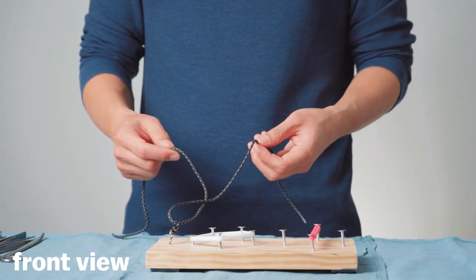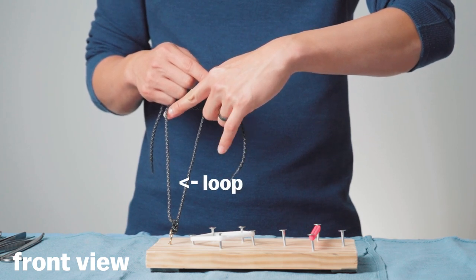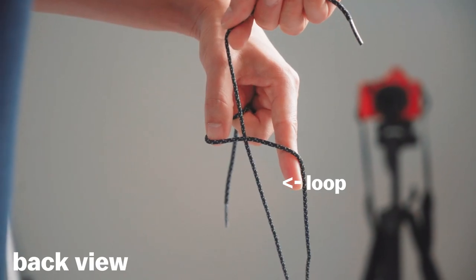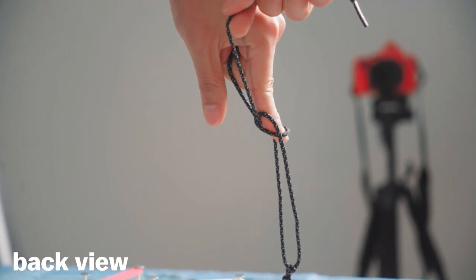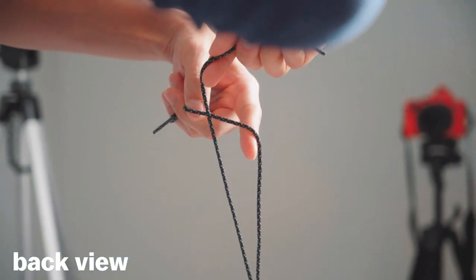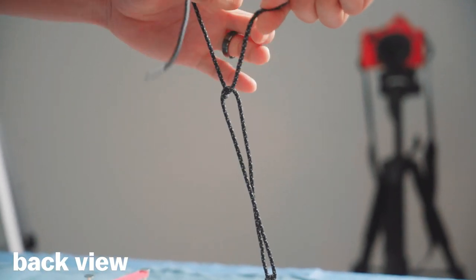Doing the forehand is the exact same concept. Once you've set up the loop using your index finger, you have to think about pulling this tail through the loop using that index finger. The way we accomplish that is by curling your index finger around the tail and flicking it out through that loop. To show you again: you create the loop, you take your index finger, you curl it around the tail, and then you pull it through the loop.